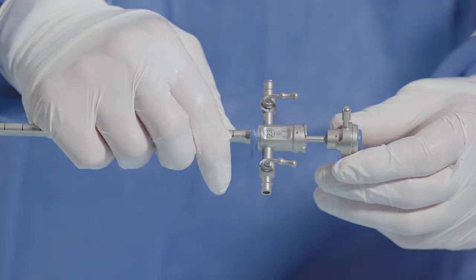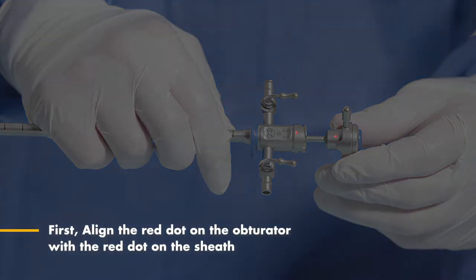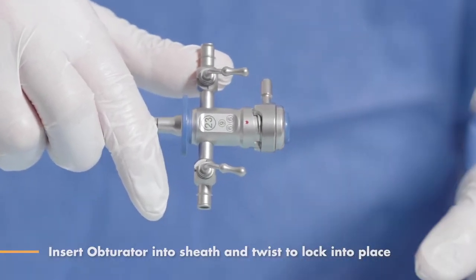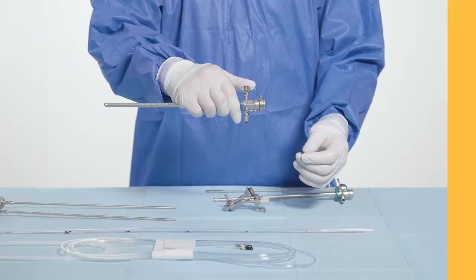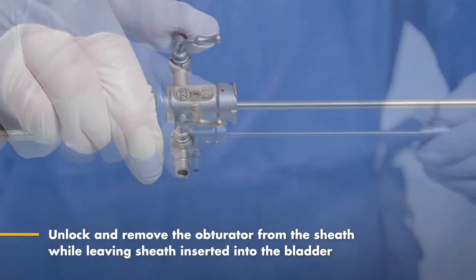Here are the steps to set up the hardware for catheterization. First, align the red dot on the obturator with the red dot on the sheath. Insert the obturator into the sheath and rotate to lock it into place. When the hardware is ready, the surgeon will insert the sheath-obturator complex into the patient via the urethra. Then unlock and remove the obturator from the sheath while leaving the sheath inserted into the bladder.